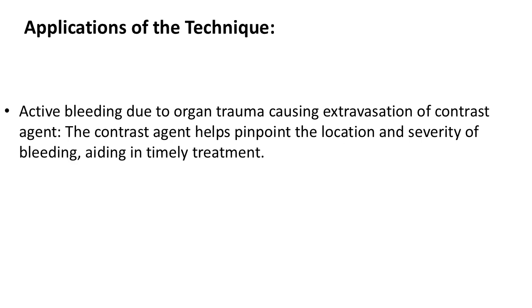Applications of the technique: active bleeding due to organ trauma causing extravasation of contrast agent. The contrast agent helps pinpoint the location and severity of bleeding, aiding in timely treatment.